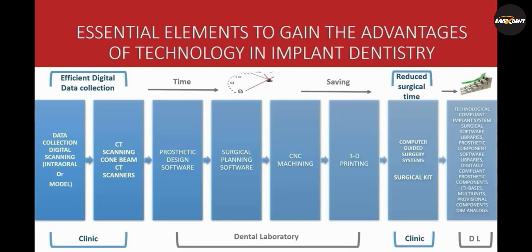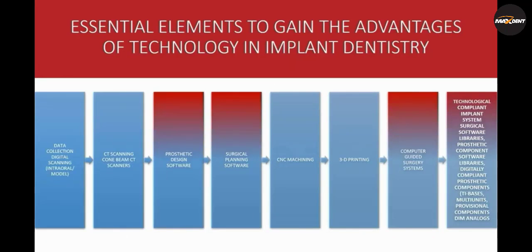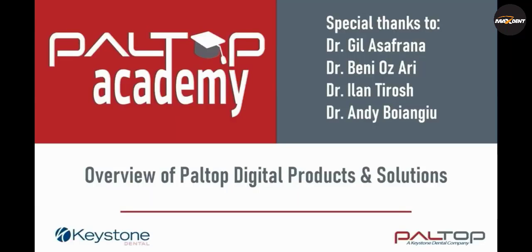Your next appointment will be on the day of surgery, where you will have all the necessary components ready in advance, such as the surgical guide, implants, abutments, temporary restoration, instruments, regenerative materials, and more. In today's lecture, I will focus on the prosthetic and surgical software, the guided surgery system, and the technologically compliant implant system of Paltop. In my role as service provider, I often go out to assisted surgeries, offering technical support.